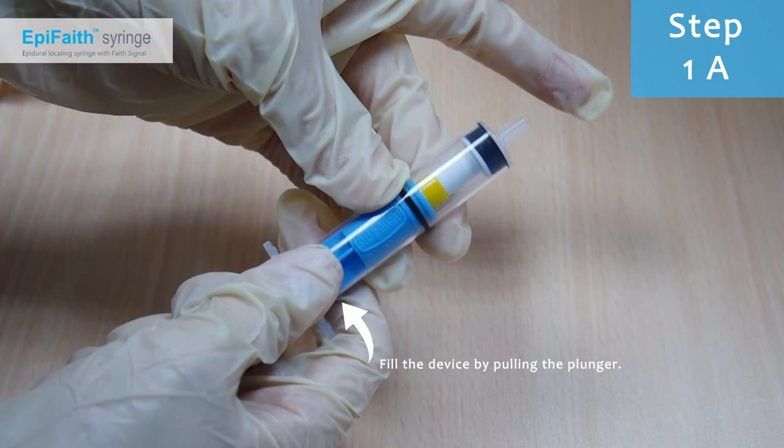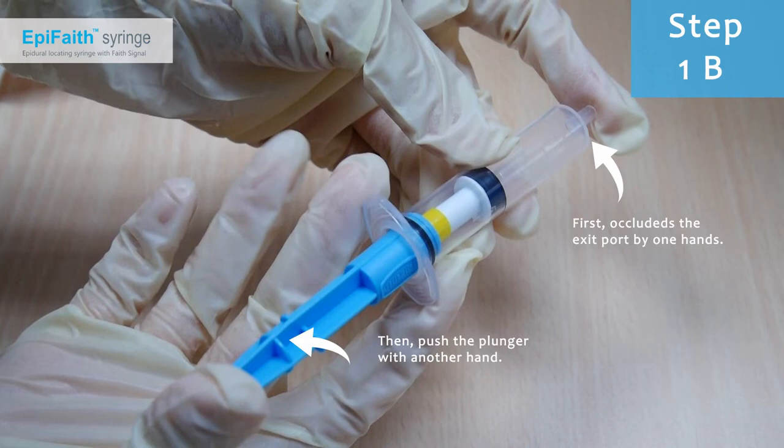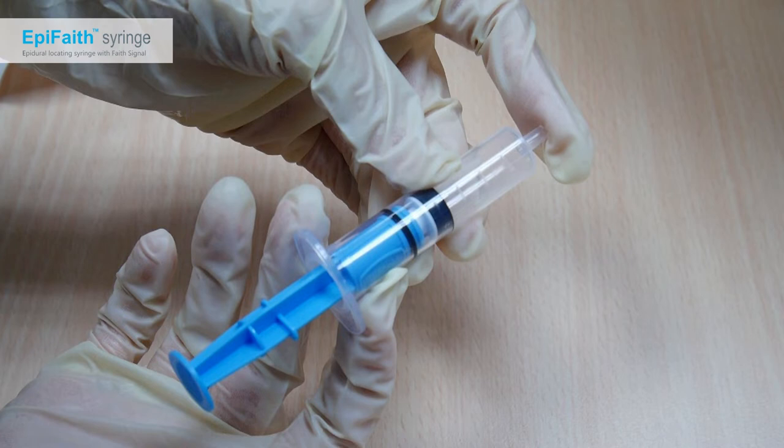Fill the syringe by pulling the plunger. After filling the syringe, use one hand to cover the exit port. Use another hand to push the plunger until the collar ring is hidden. Do not hold the plunger after pushing. Keep the exit port closed. The collar ring should remain hidden, as this indicates there is no leakage on the rubber piston's seal.